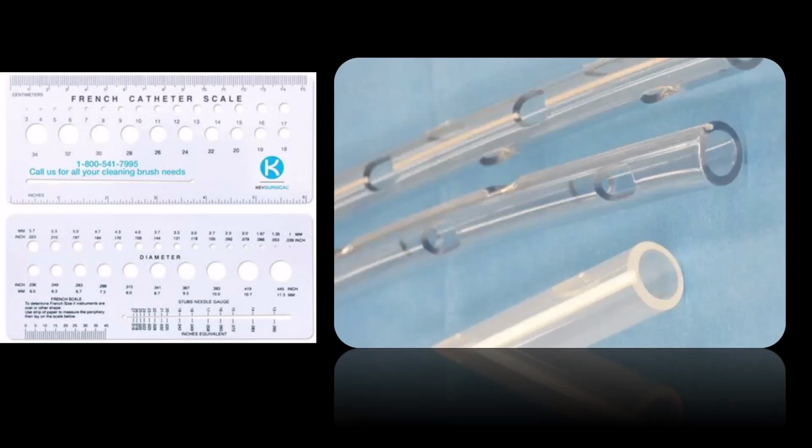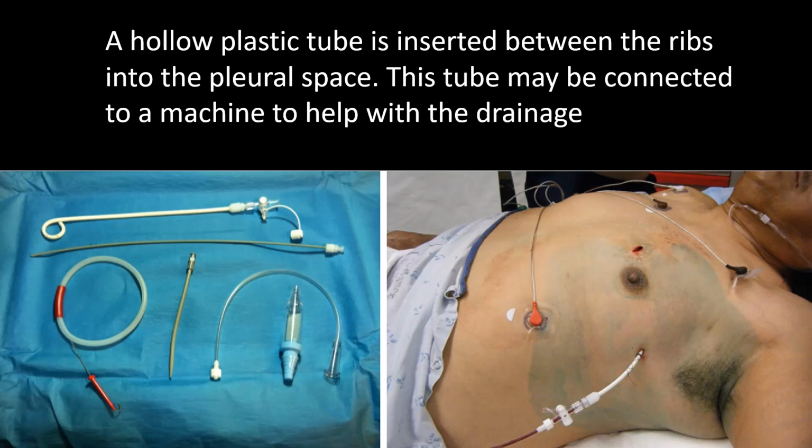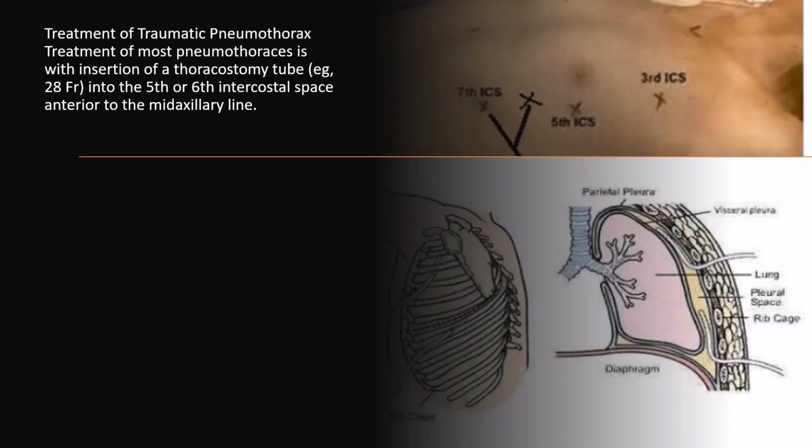A hollow plastic tube is inserted between the ribs into the pleural space. It may be connected to a machine to help drainage. The placement of the thoracostomy tube is into the 5th or 6th intercostal space anterior to the mid-axillary line.